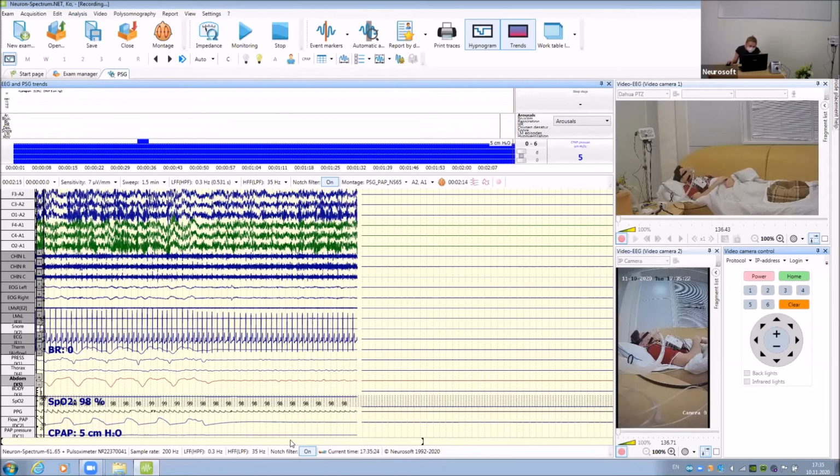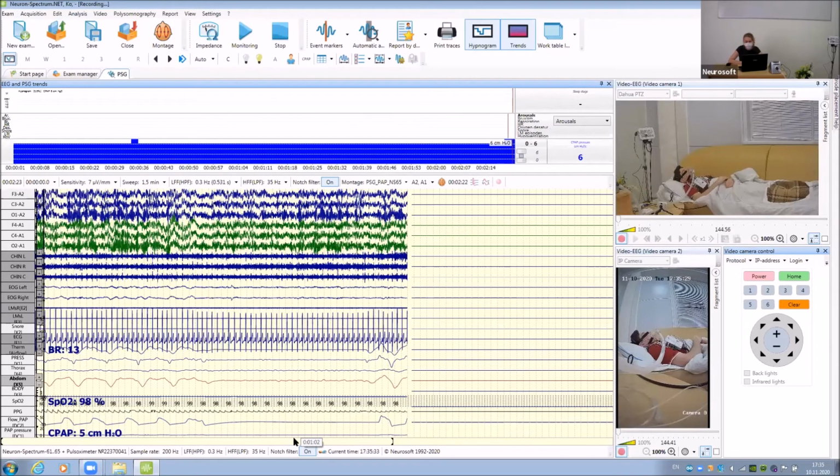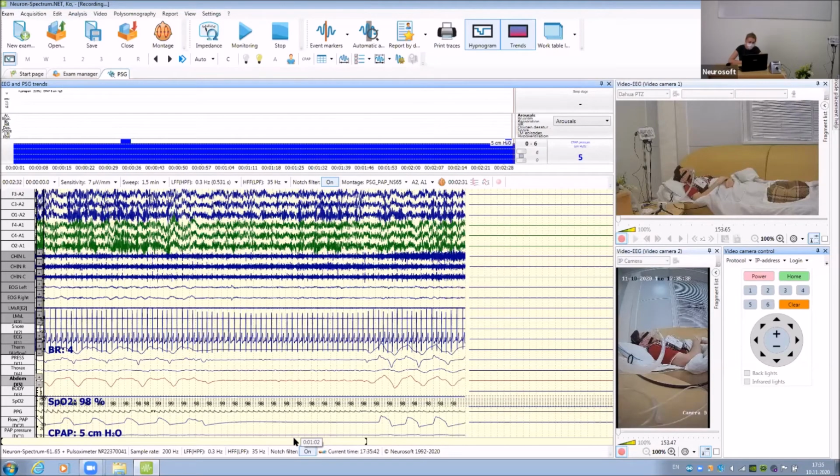Okay, thank you, Anton. And now we get the normal breath. But we suppose that these pauses during breathing mean that our therapy is not effective.